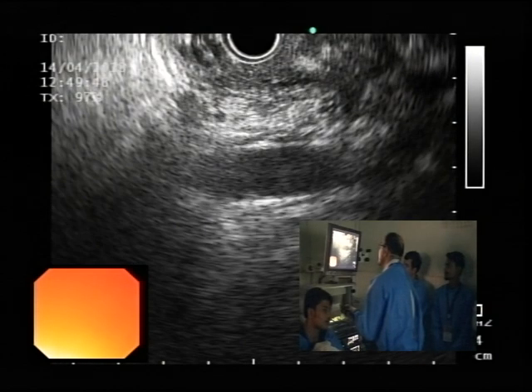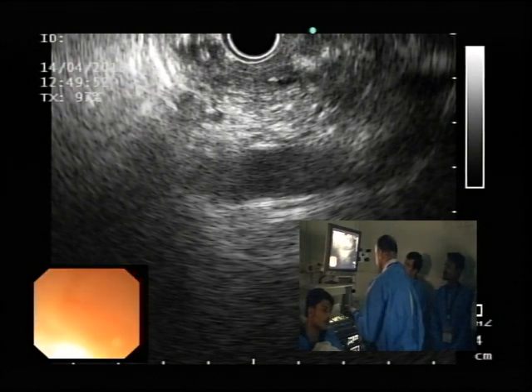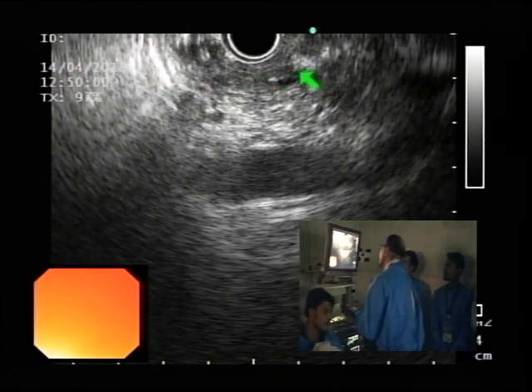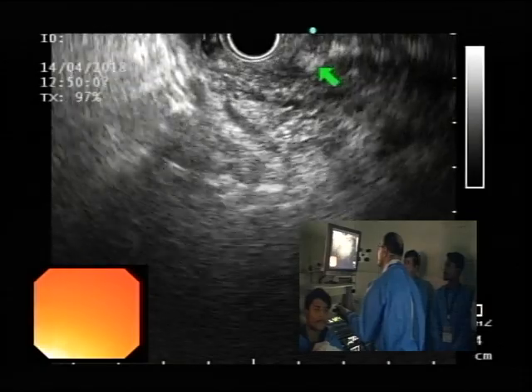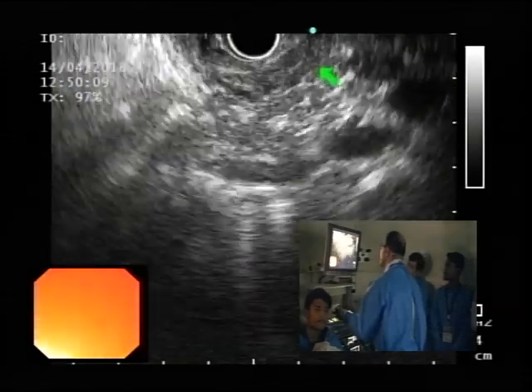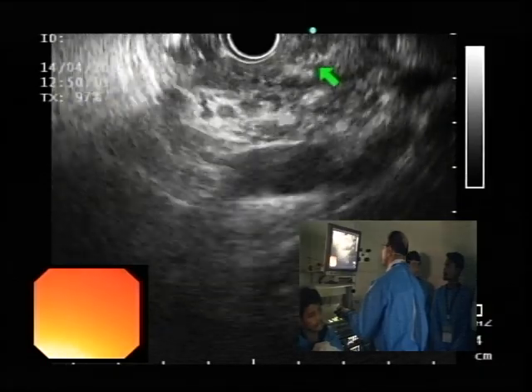And so now, if I scroll in, you see this white stuff. So this is bile duct and this is air. When I was moving, you could see there was a movement up this way, and that was air refluxing back into the bile duct. Yes. I will try and demonstrate that again. Right there. And as I go counterclockwise, you see that structure right where the arrowhead is?